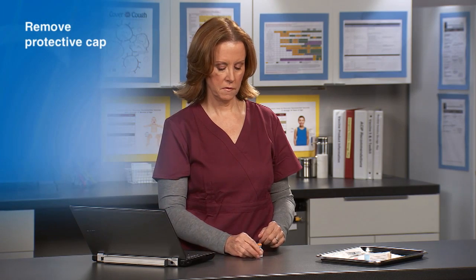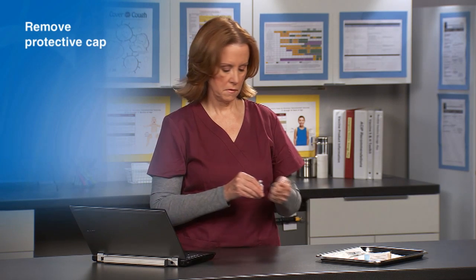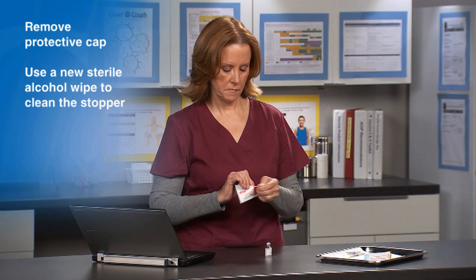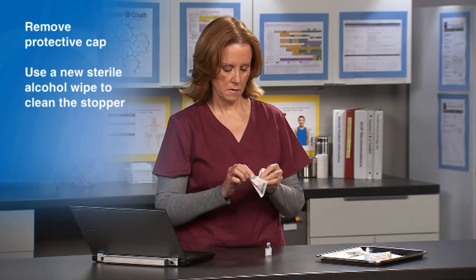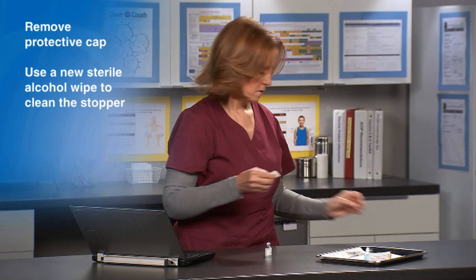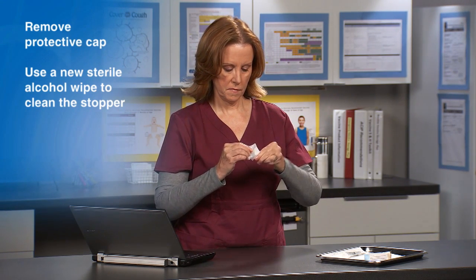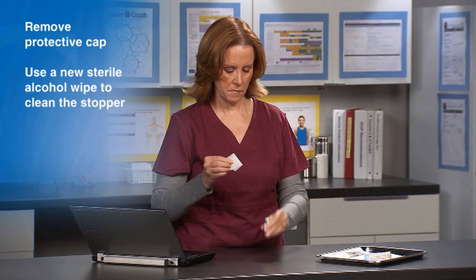Remove the protective cap from the vial if present. Use a new sterile alcohol wipe to clean the stopper on top of the vial. Do not rub the stopper vigorously, as this can move bacteria from the uncovered rim of the vial to the stopper.